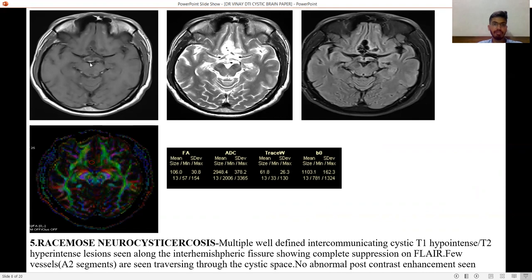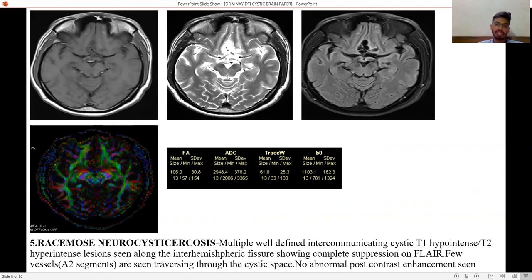Fifth is racemose neurocysticercosis — multiple well-defined intercommunicating cystic lesions, T1 hypointense and T2 hyperintense, seen along the interhemispheric fissure, showing complete suppression on FLAIR images. Few vessels of the A2 segment are seen traversing through the cystic space, and no abnormal post-contrast enhancement is seen.